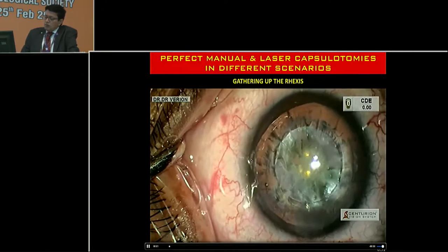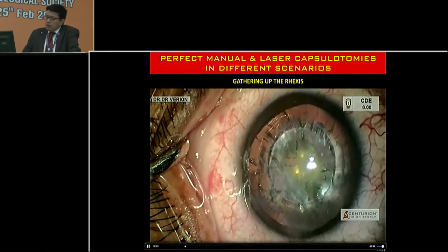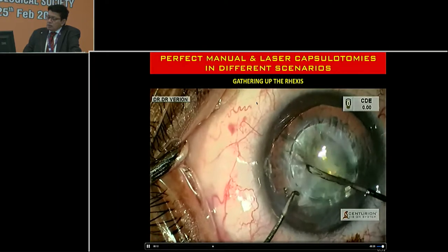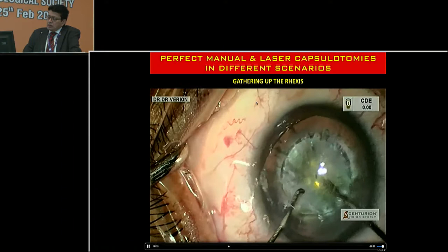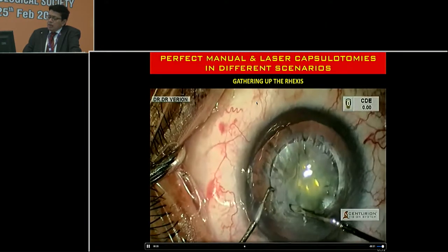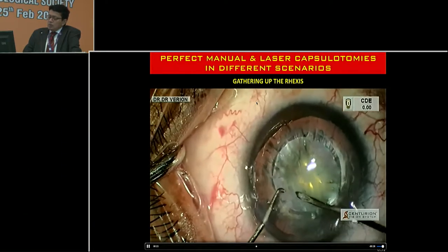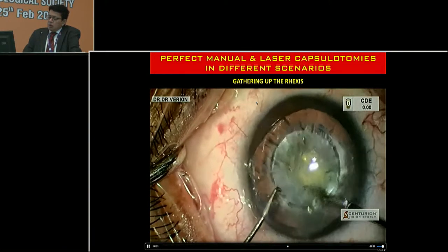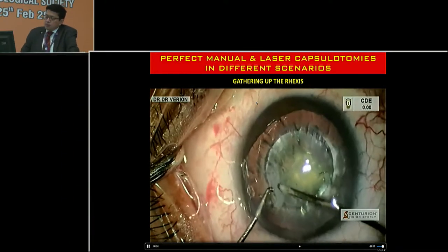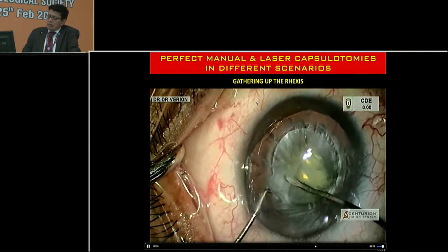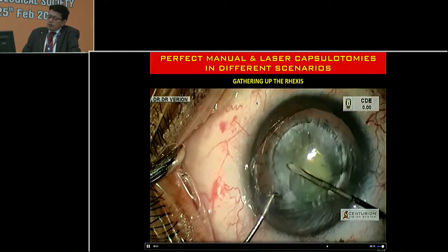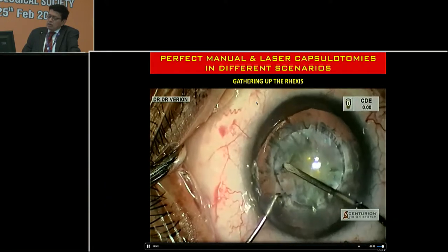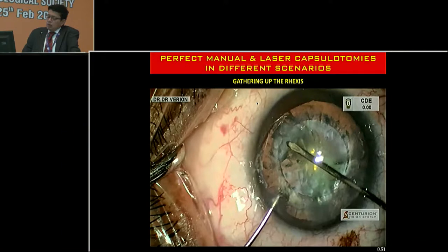This is a slightly more fibrous capsule, making it more obvious. Even though a femtosecond laser has been applied and the template of the capsular rhexis is visible, it is extremely important not to pull on this rhexis. Go in with a bent 26-gauge needle and gather up the capsule in the center — the maneuvers are exactly similar to what you would do for a regular capsular rhexis. The advantage is a perfect template that has been created using the platform, with only micro-adhesions remaining. You have to combine years of technique with the advantage the femtosecond platform gives. Areas of stronger adhesions can be freed up, and it is always possible to remove the capsule in one piece.